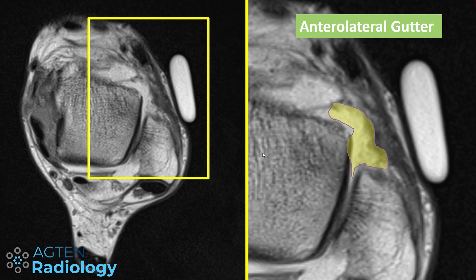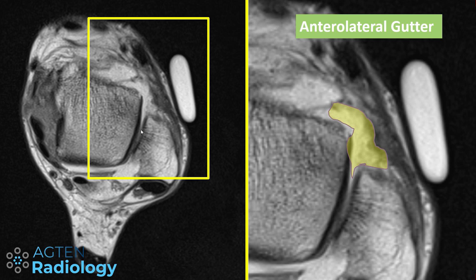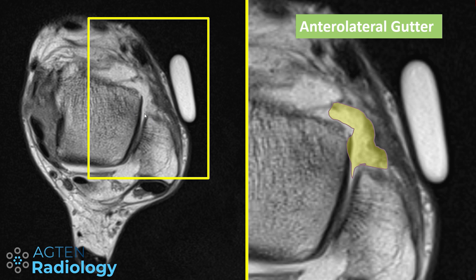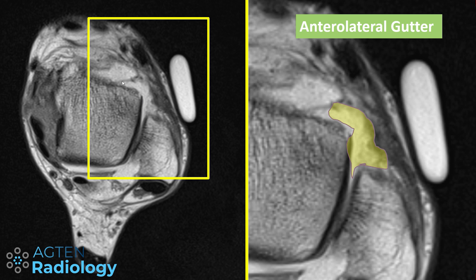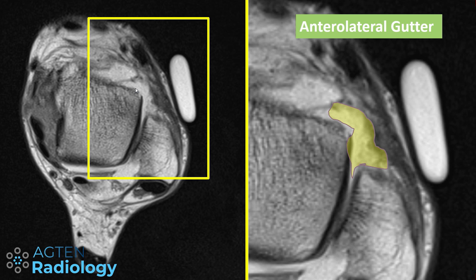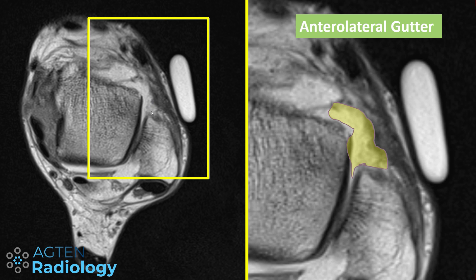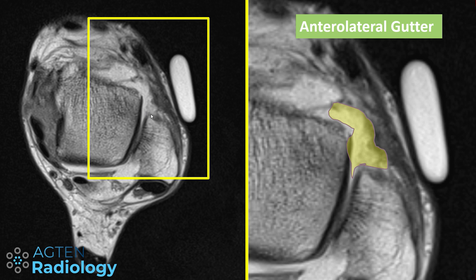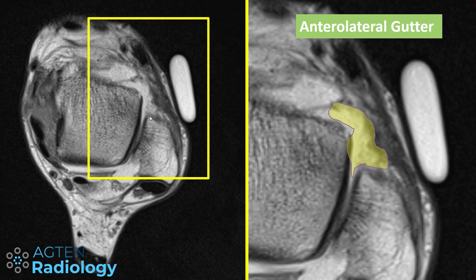So what is the anterolateral gutter? Here we can see a patient with a marker indicating pain at this level. The anterolateral gutter is the space just below the anterior syndesmosis and above the ATFL — or inside of the ATFL — and above the fibulocalcaneal ligament. If you have any kind of mass such as synovitis, scar tissue, or a ganglion cyst in this region, it can lead to anterolateral impingement.